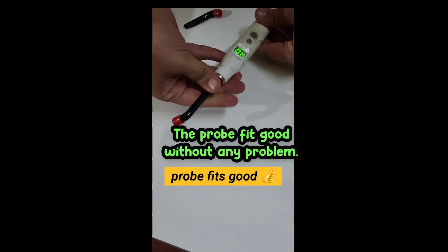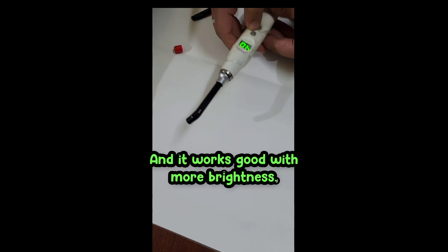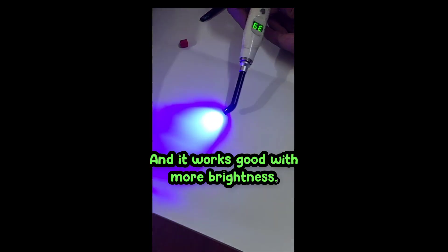And my fear is gone. The probe fits well without any problem and it works well with more brightness.